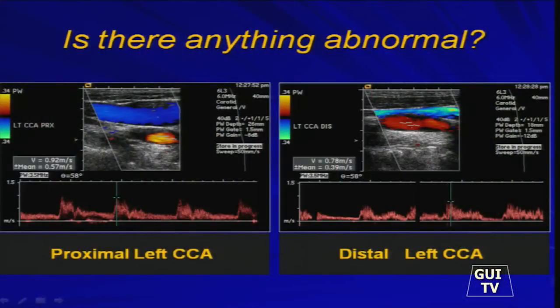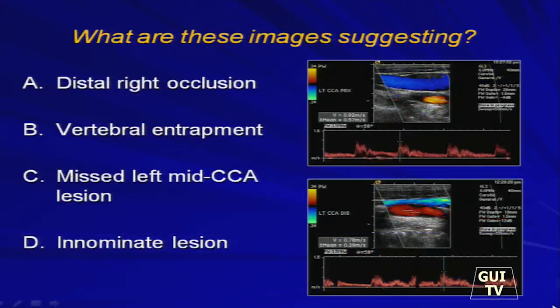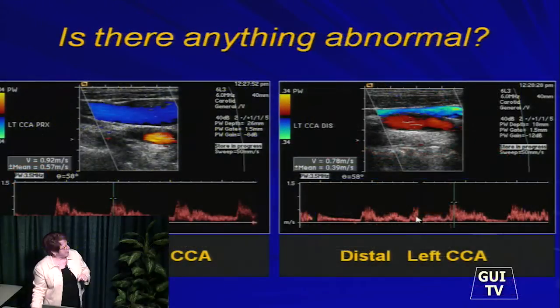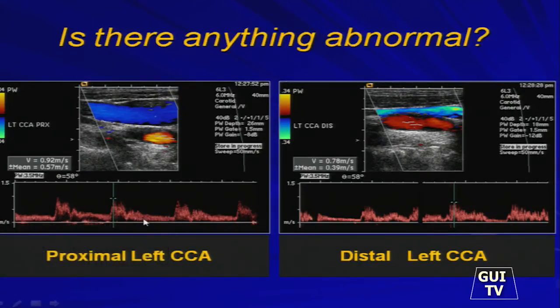Is anything standing out here that isn't quite right, and if so, what's not right? So what are these images suggesting to you? Over here, I don't see low diastolic flow — I'm not seeing the quality of diastolic runoff that I'm seeing in the proximal. But I do see diastolic flow. I don't see diastolic flow go to zero on all the waveforms. So not our best choice.